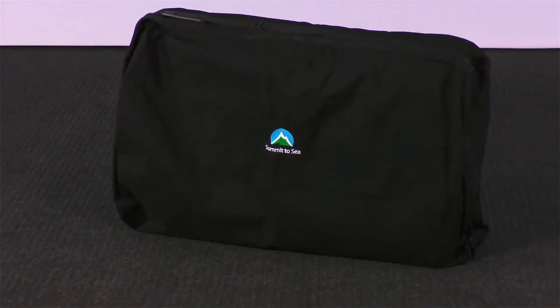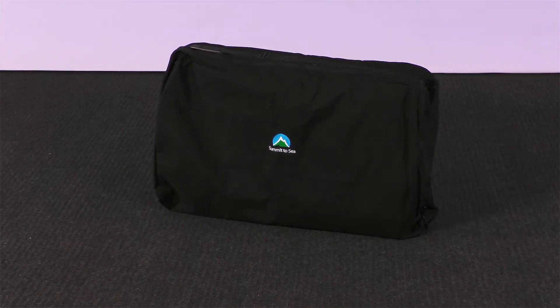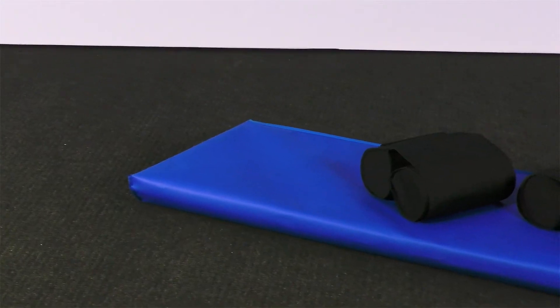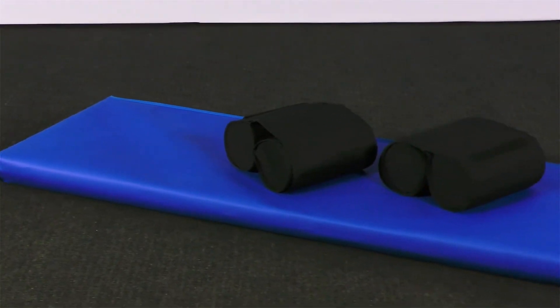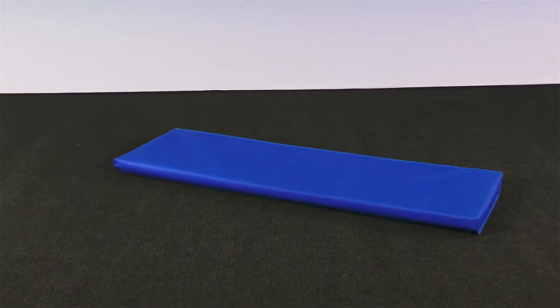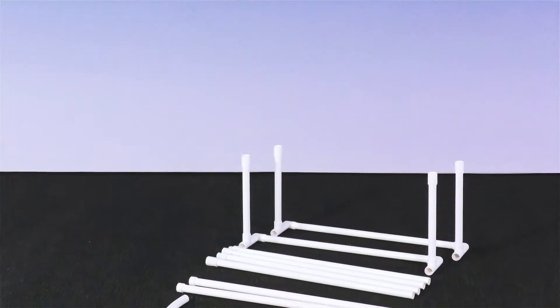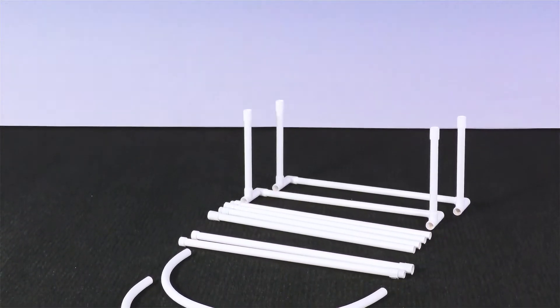Now let's discuss the items that are included in your boxes for your hyperbaric chamber. First, we have the chamber in a carry bag. Included with the chamber are two sets of cradles to stabilize the chamber, and a foam mat to provide comfort during your treatment. Next, you will see an external frame designed to fit around your chamber.